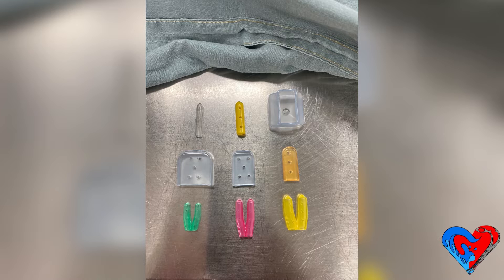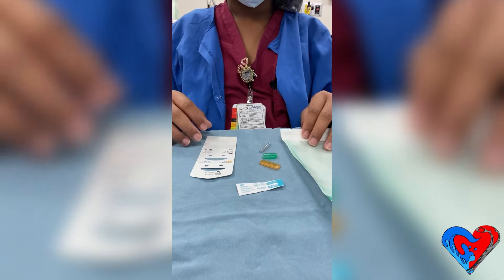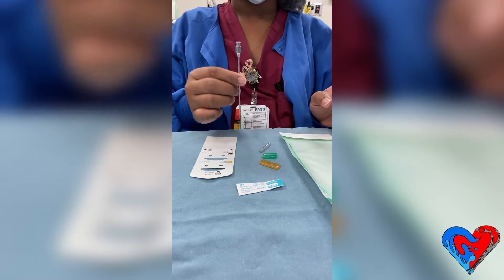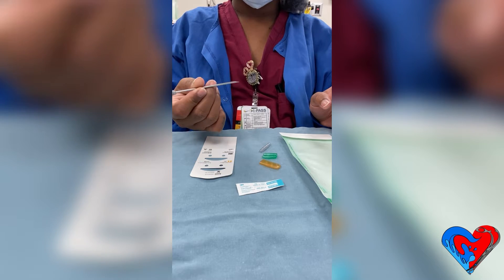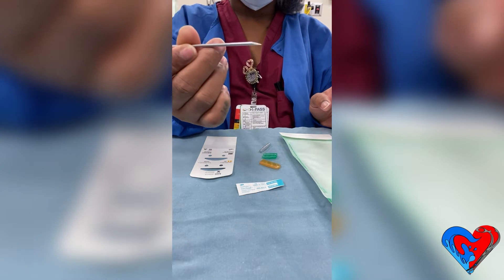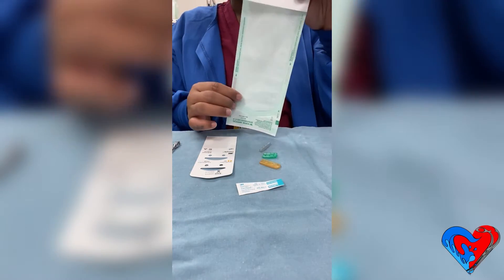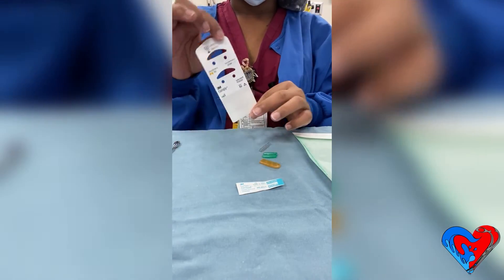I'm showing you the different types of tip protectors you can use. I'm going to walk you through how I pill pack a cannulated instrument. I have a few things in front of me: different kinds of tip protectors, an integrator, the pill pack, and an instrument protector.